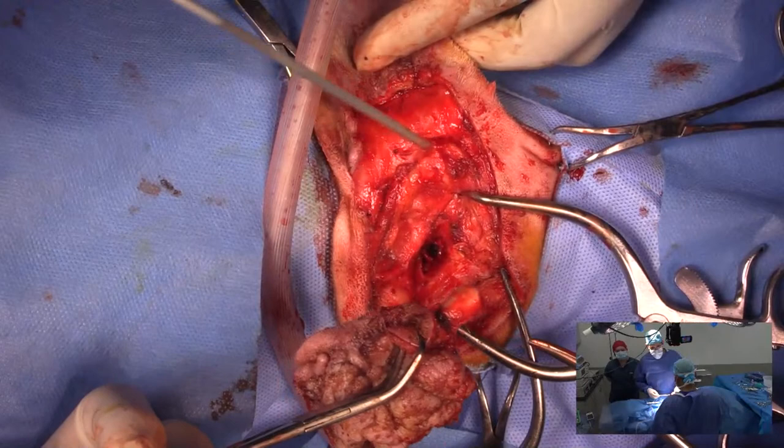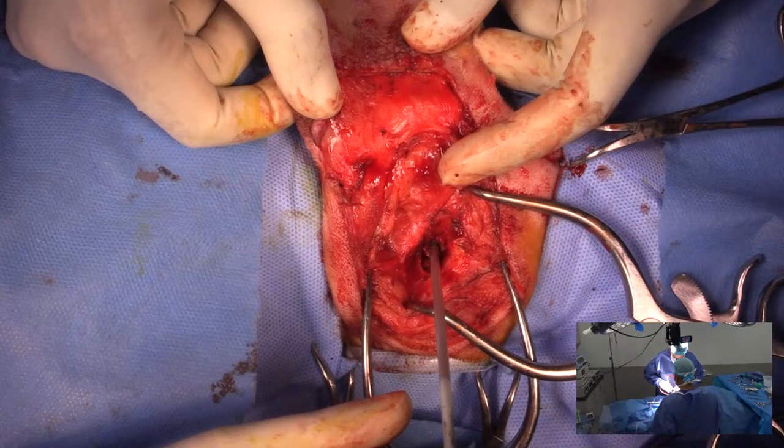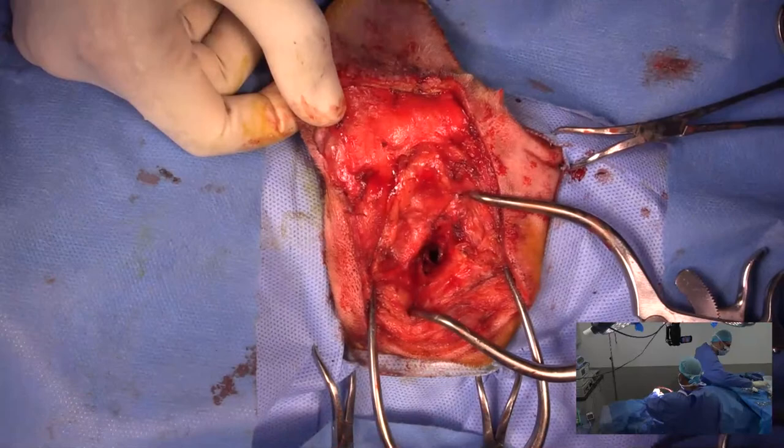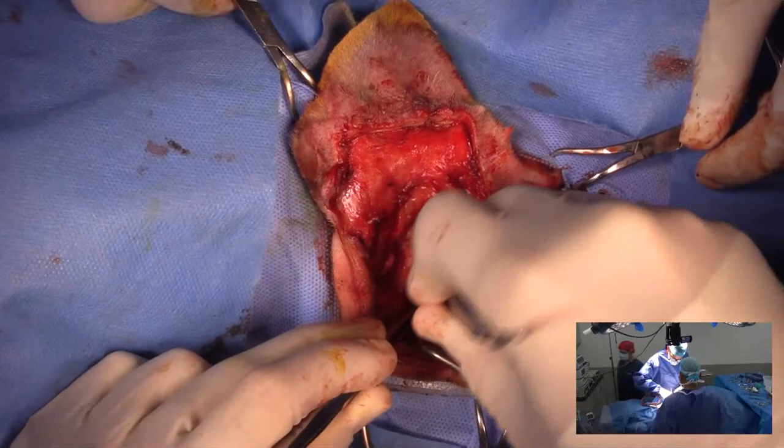So you get the suction right down in the ear canal down here and into the tympanic bulla. And that's facial nerve sitting right there. So the next thing I'm going to do is use a freer elevator and just dissect ventral to the tympanic bulla. So I've got that bulla exposed ventrally down here. Okay, so now I've got that freer elevator ventral to the bulla.